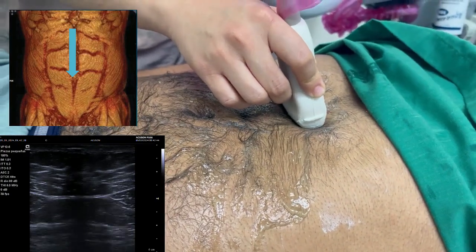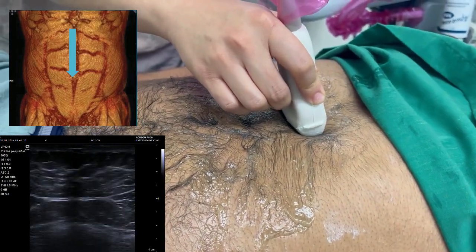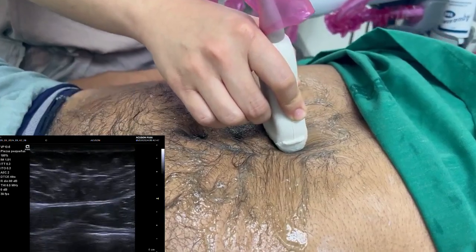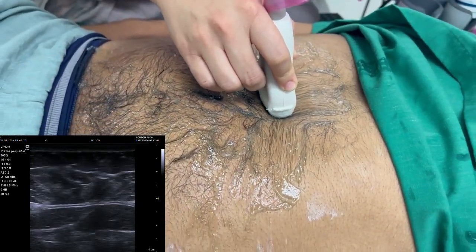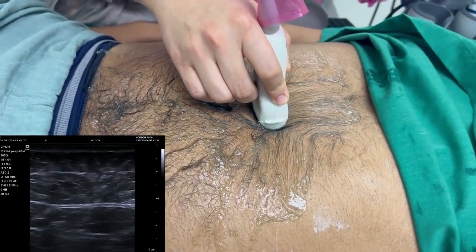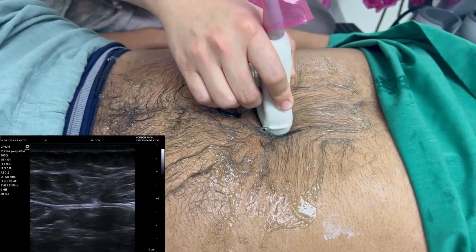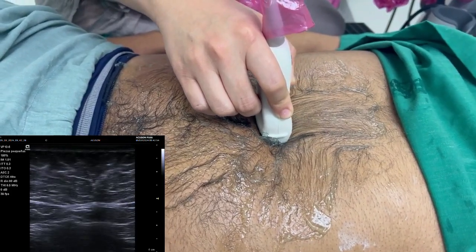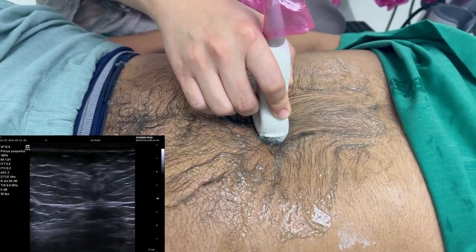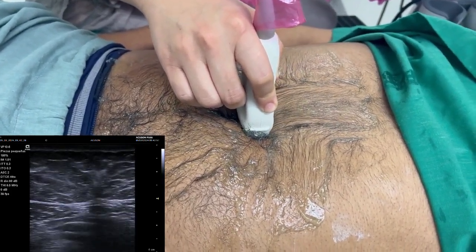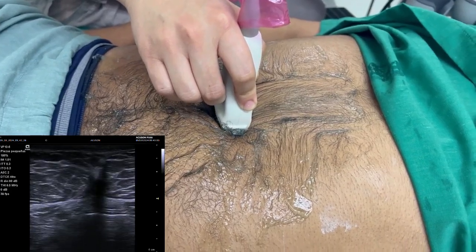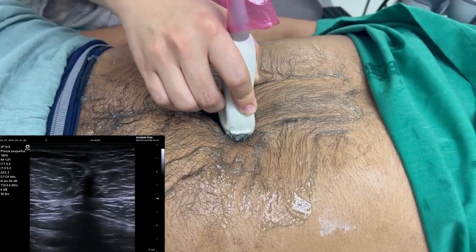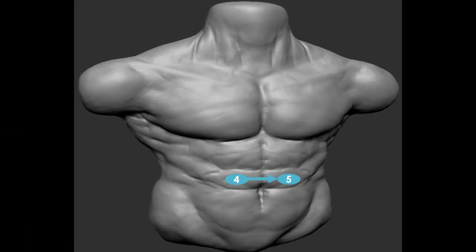An extension of step 3 is tracing the midline cranially to rule out hernias. If we lose the border of the linea alba during this tracing, we relocate the medial border of the right or left rectus abdominal muscle.